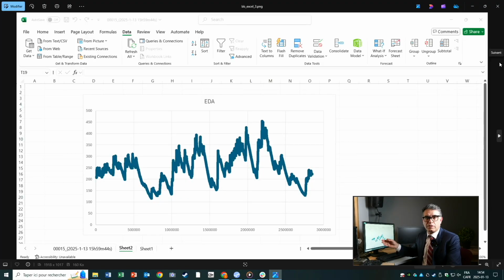So what you have here, if you extract the micro SD card and use a card reader, you're able to go and extract the file and have a look at the exact raw data collected during the experiment. For example, you may want to use software like Excel, like here, just to graph the data. This is very useful to have a stronghold on what you're actually capturing and maybe do some quality assurance of the data that you're recording throughout your experiment.